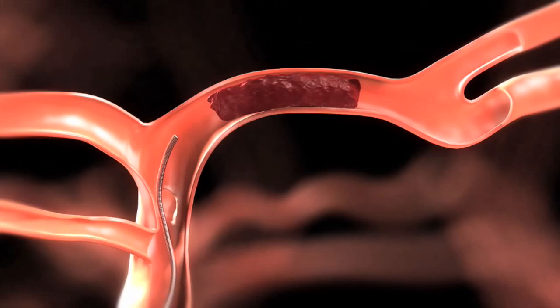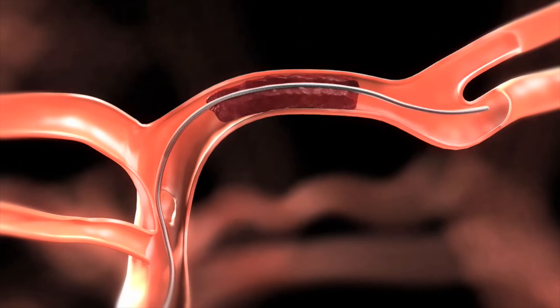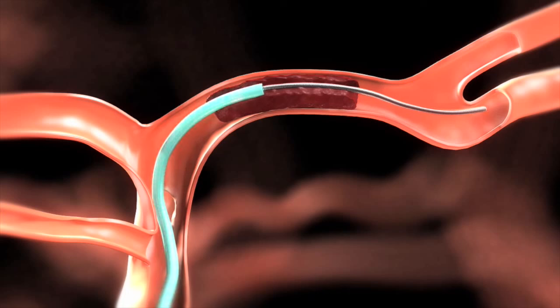and we catheterize the arteries inside the brain, the carotid artery, and into the middle cerebral artery. You can see the clot within the middle cerebral artery, which supplies blood to that half of the brain. So, we bring up our microcatheter all the way up into the middle cerebral artery in the brain and cross the blockage.